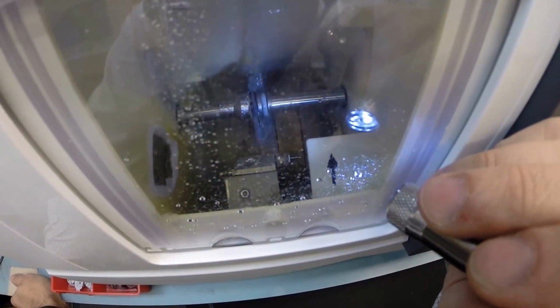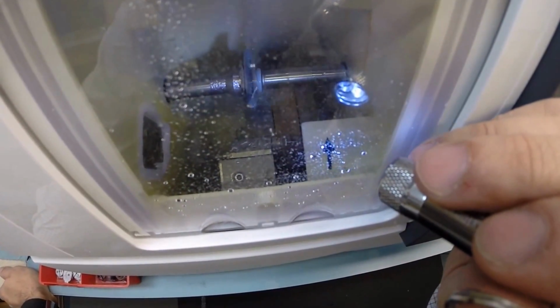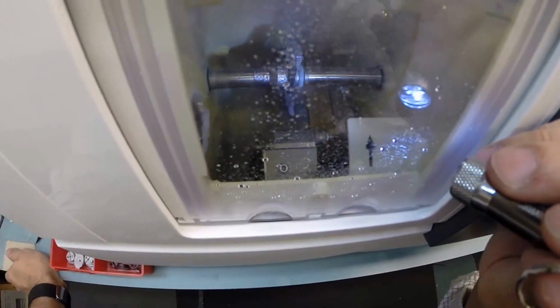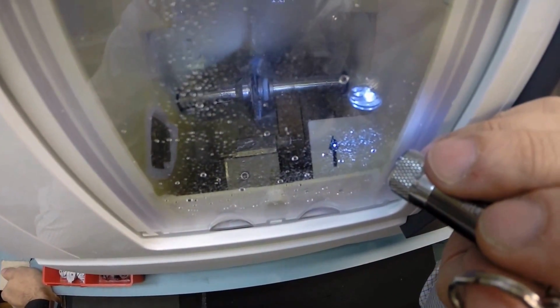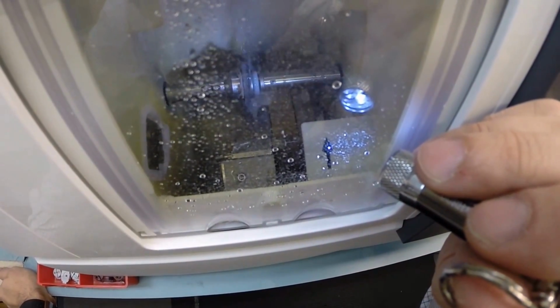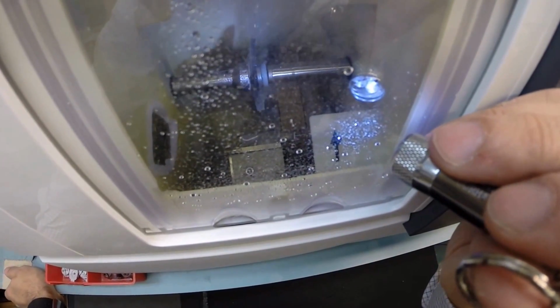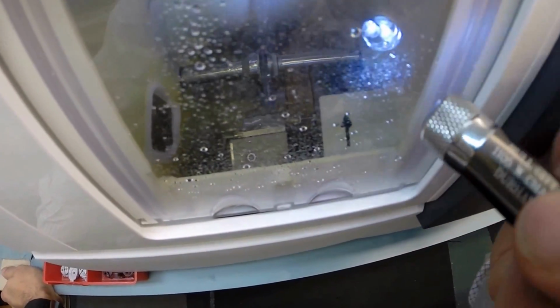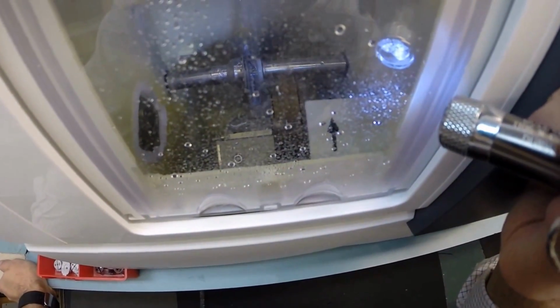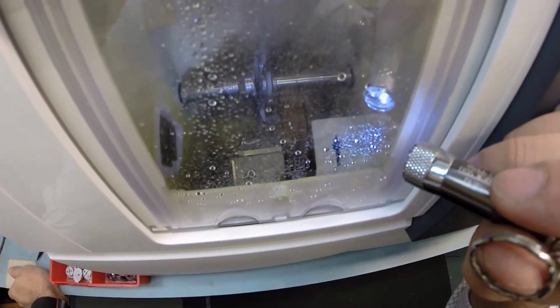Now I am putting a polish on your lenses. The polish is being applied now just because I'm concerned about the edge thickness. I'm going to make sure you have the highest cosmetic quality possible. Water kicks in for the last 20 seconds of the cutting cycle just to wash away any optical debris. Polycarbonate lenses cut dry where plastic and high index lenses cut wet.